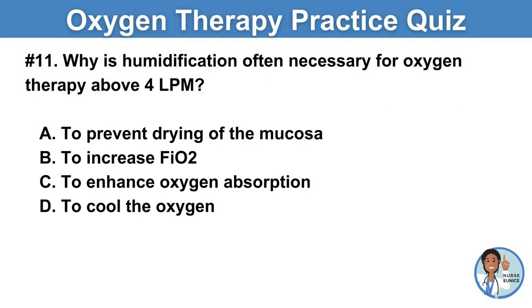Number 11, why is humidification often necessary for oxygen therapy above 4 liters per minute? Is it to prevent the drying of the mucosa, to increase the FiO2, to enhance oxygen absorption, or to cool the oxygen?